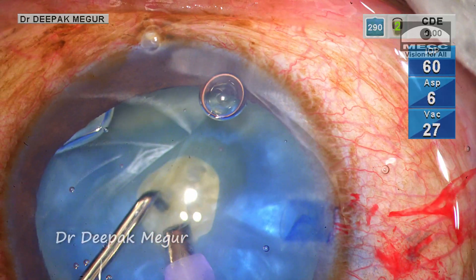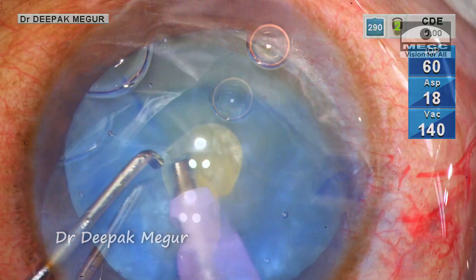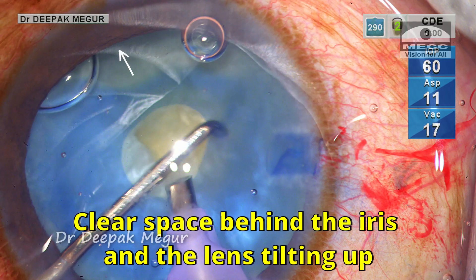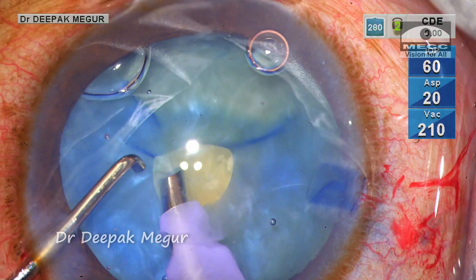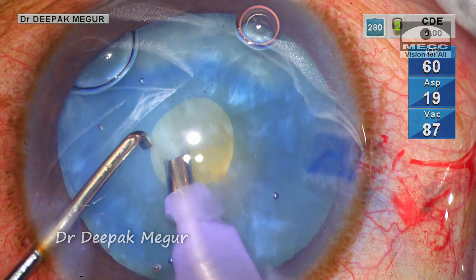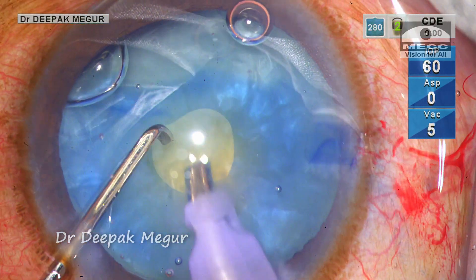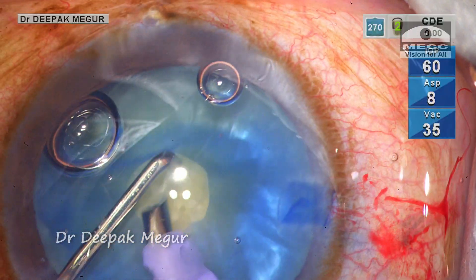As the cortex is being aspirated, the distal half of the nucleus tilts up momentarily and I catch a glimpse of a clear area under the iris. I can see a radial fold in the anterior capsule — more folds appear and the shape of the rhexis margin changes. It is now quite obvious that we have significant zonular weakness in this distal quadrant.